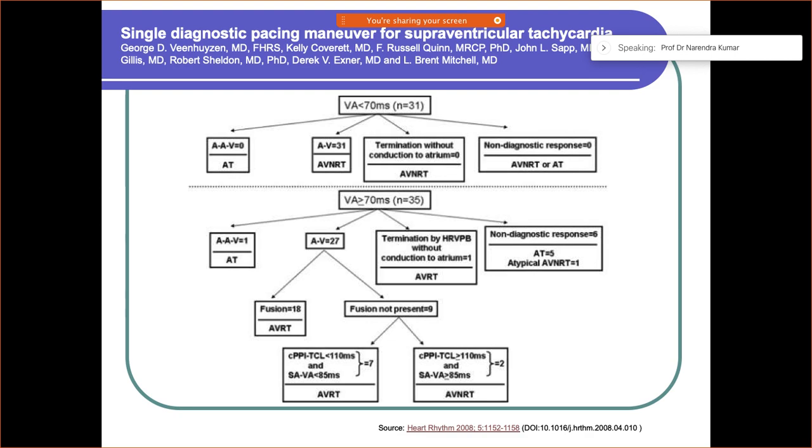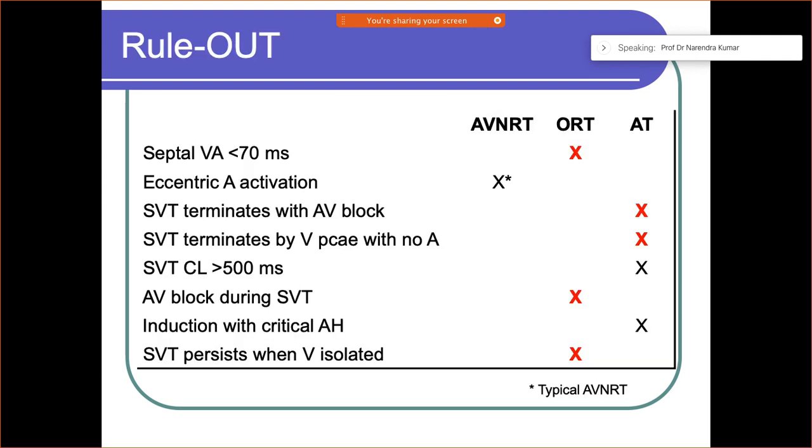I would really like you all to master this technique. There will be other things as well which I'm going to show you. Other than this, as I said, these are the different tachycardias. Whenever you deal with them, how will you differentiate between them? This really assumes a lot of importance.